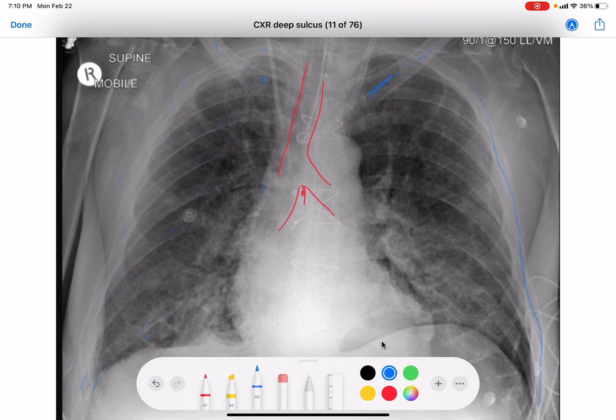C for cardiac silhouette. Here's the silhouette coming down here, and I don't see much going on there.